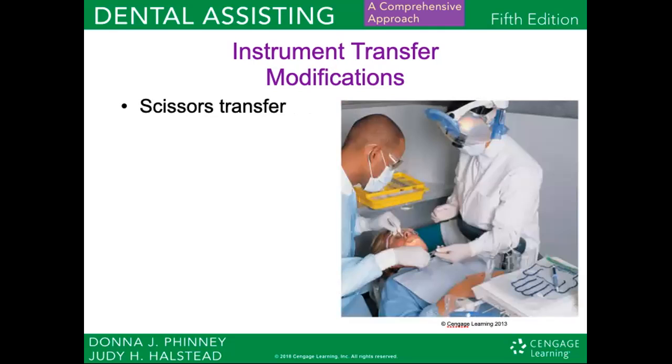Scissors are transferred as the assistant picks up the scissors at the hinge near the working end with them slightly opened. When you slightly open the scissors, it makes it easiest for the operator to grab the scissor handles and start working with them right away.